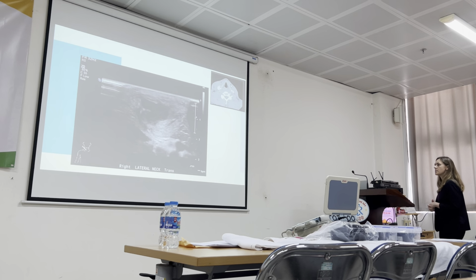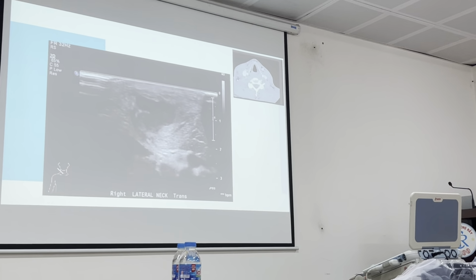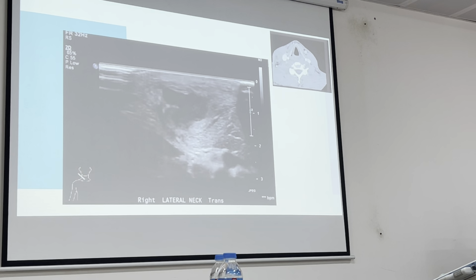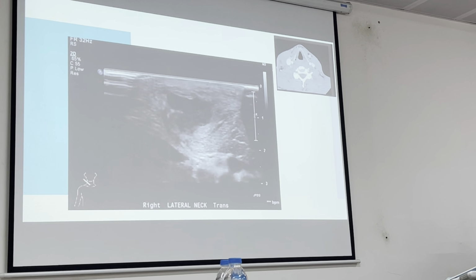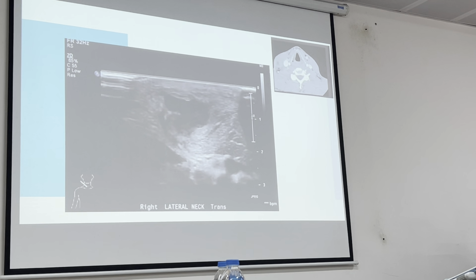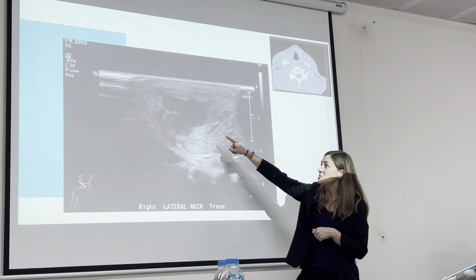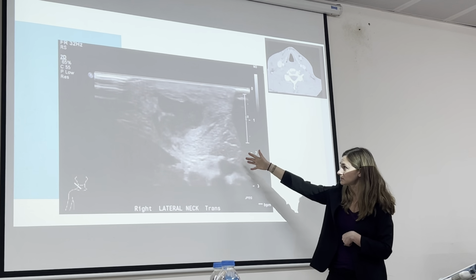So if we were to go maybe in order, we can look at, what do the borders look like? When we think back about that lymph node, how were the borders around it? They were pretty round and pretty well encased. What do we think about the borders of this structure here? They're a little fuzzy. Yeah, it's a bit irregular, uneven. And I agree, maybe this is a hilum. It's hard to tell without color. It could be a septation.